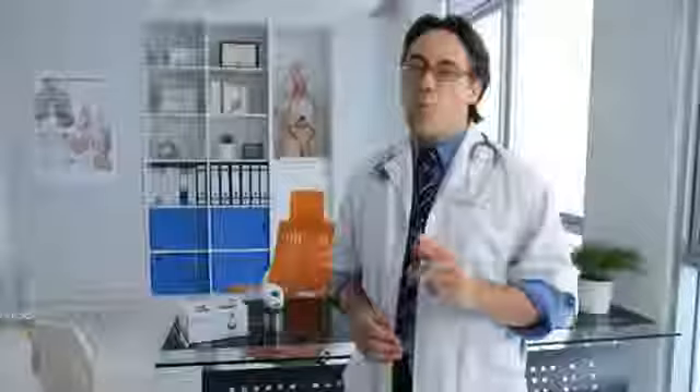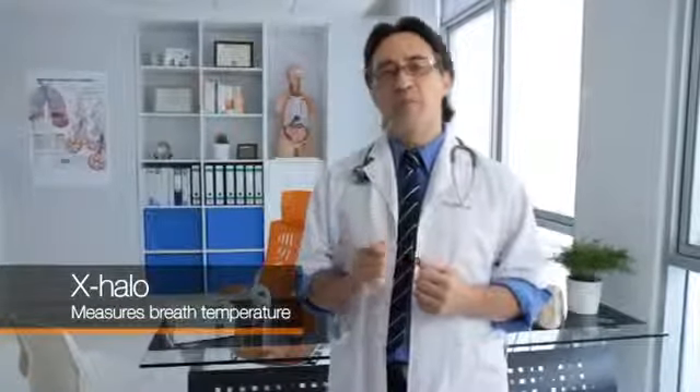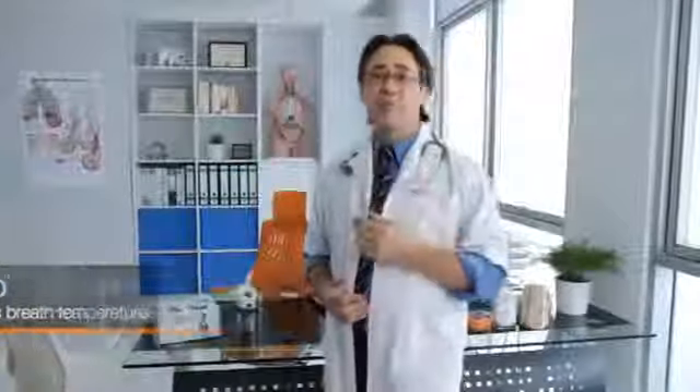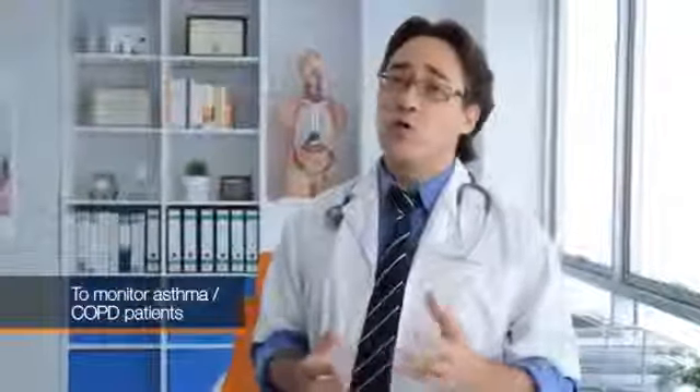The X-HALO Breath Temperature Meter is quite a remarkable device. By measuring the Exhaled Breath Temperature (EBT) of a person, it can help determine the presence of any airway inflammation. EBT being a marker for airway inflammation, this device is particularly useful for monitoring patients with asthma or COPD.